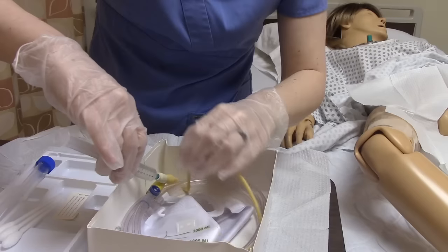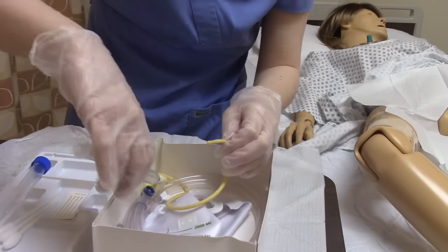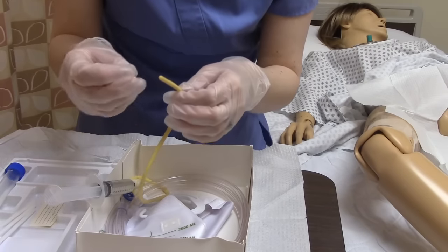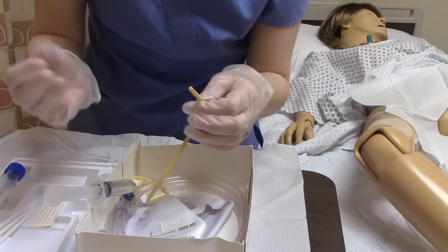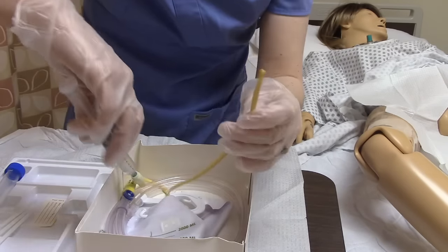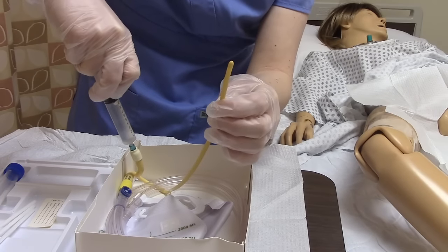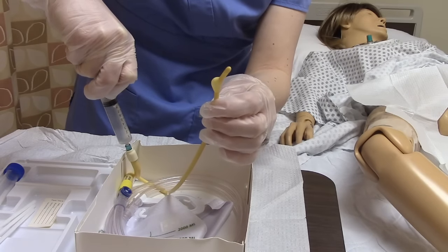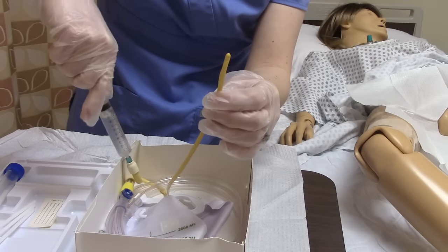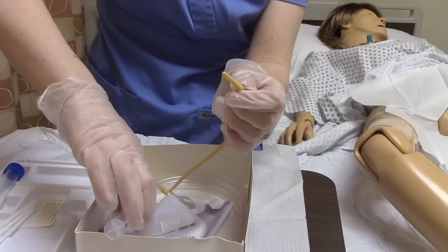I like to prepare my catheter ahead of time. I get my sterile water solution and put it in. Some manufacturers will have you test the balloon prior to insertion; some say do not test because testing could cause it to stretch out, making it more difficult to insert. But here's what testing the balloon looks like — slowly push the water in and see how it starts to get bigger, confirming the balloon is intact and working. Then get rid of the water before inserting.